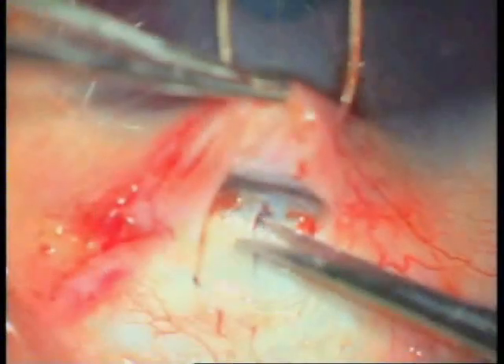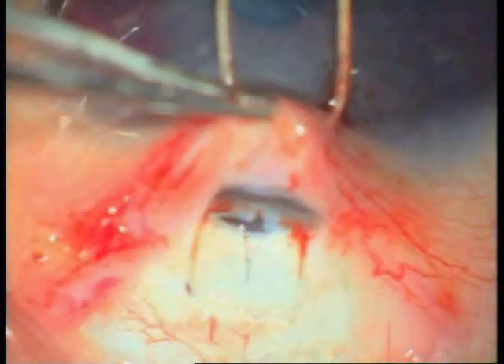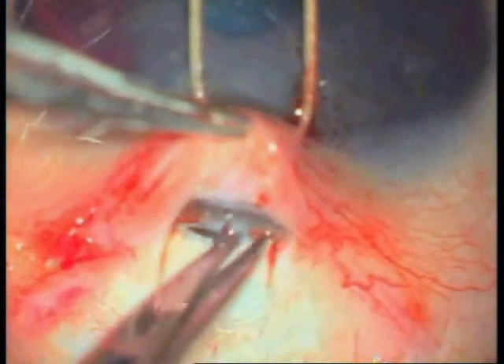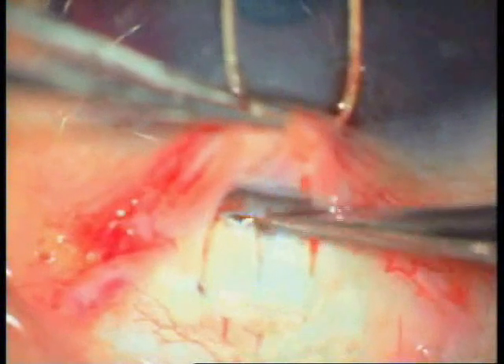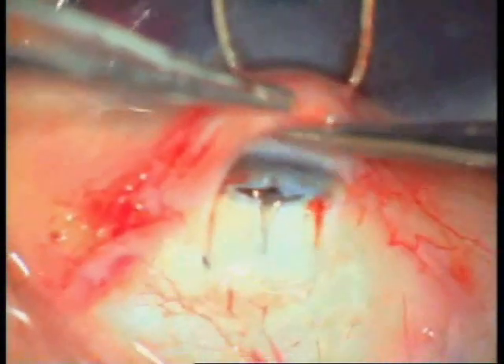As soon as the external wall of the canal is cut, aqueous starts oozing out. Since most surgeons are right-handed, the Harms trabeculotome is passed through the left side first. It is rotated into the anterior chamber to disrupt the trabecular meshwork and open the internal wall of Schlemm's canal into the anterior chamber. The same technique is used on the other side to perform around 100 degrees of trabeculotomy.